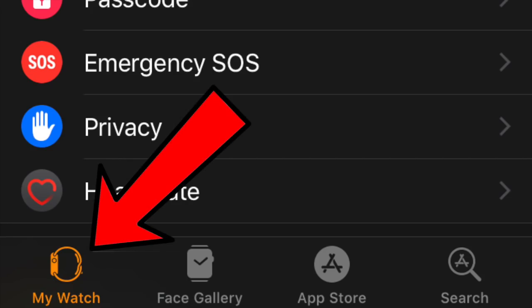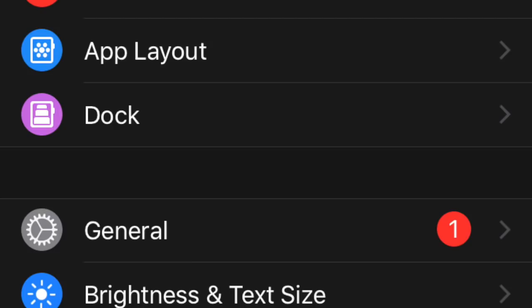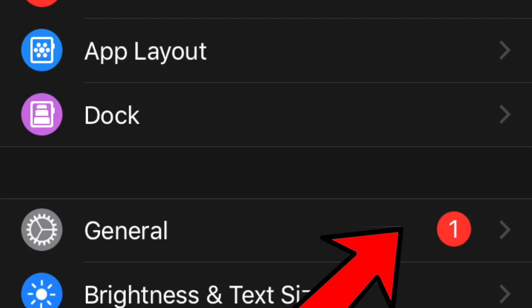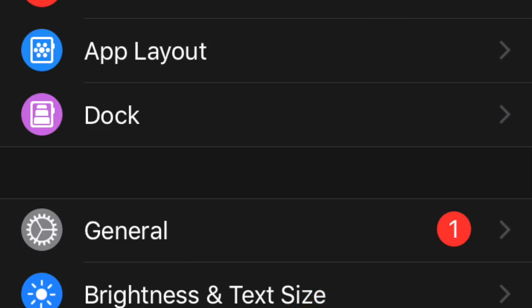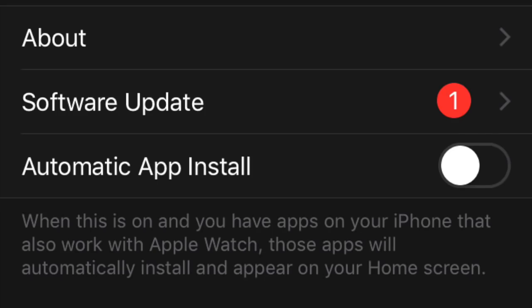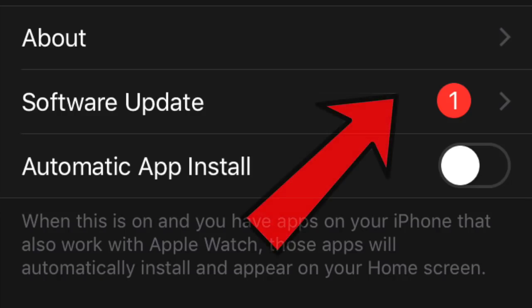If you still can't find the app after its launch, check if you have the latest version of watchOS installed. Under My Watch, go to General, then Software Updates. You might have to download and install the newest watchOS version first if you haven't done that yet.